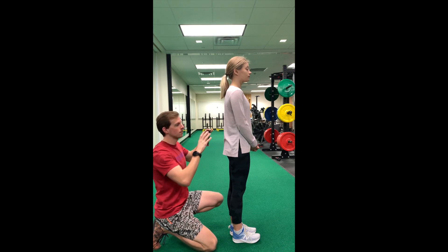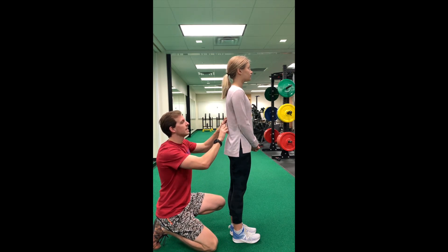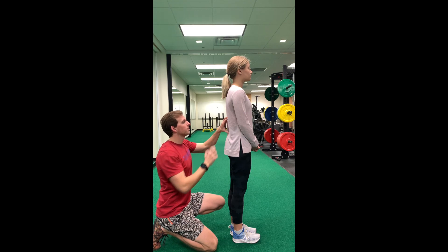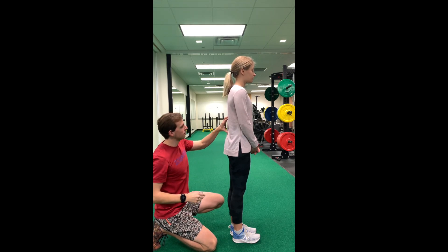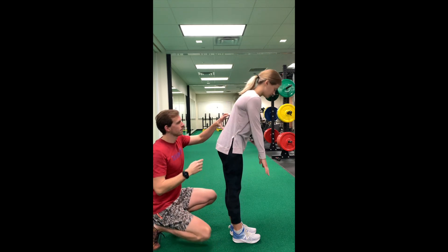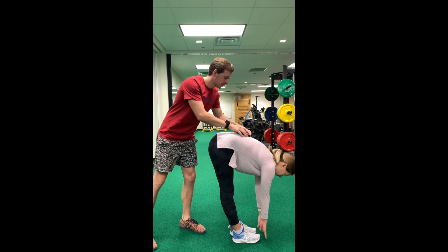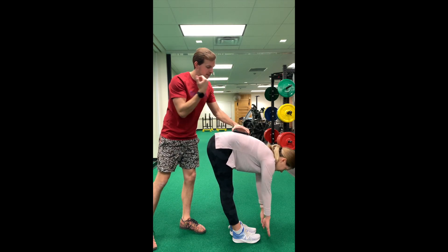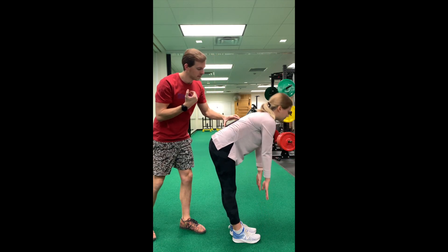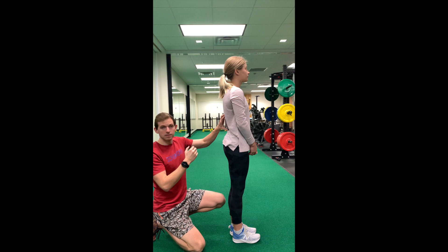Find your landmarks, place the phone correctly, and hit start. Have the patient flex forward as far as they can. Hit stop at the end range of motion, then come back up to neutral.